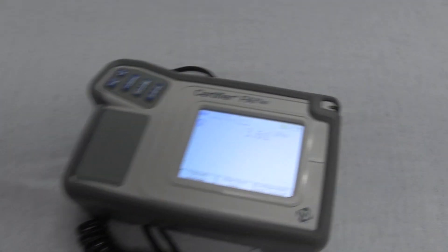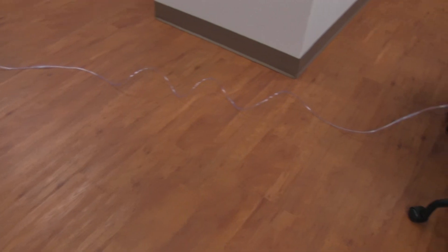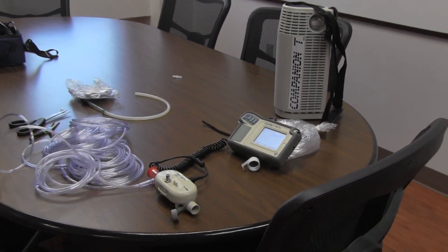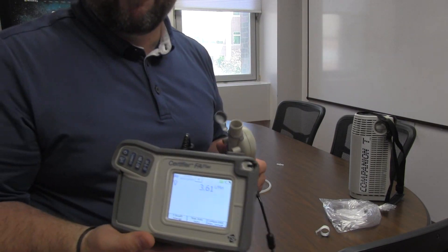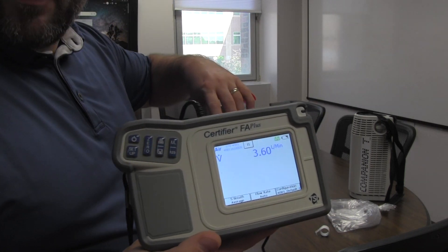The device is reading 3.60. Now let's extend the tubing out — the oxygen tubing is running all the way across the room to the table. We're currently reading 3.61, essentially the same reading. Those are seven-foot oxygen extension pieces and there are four of them, so 28 feet total, sealed up well.